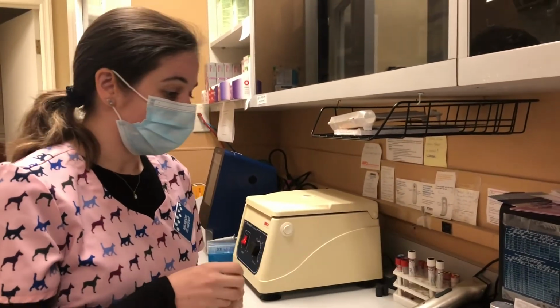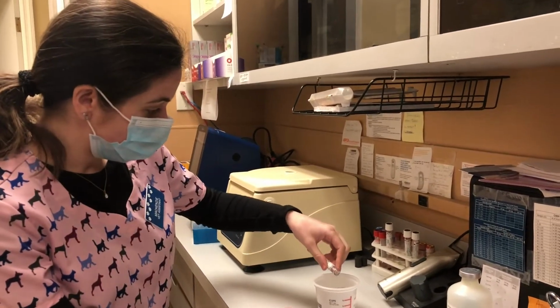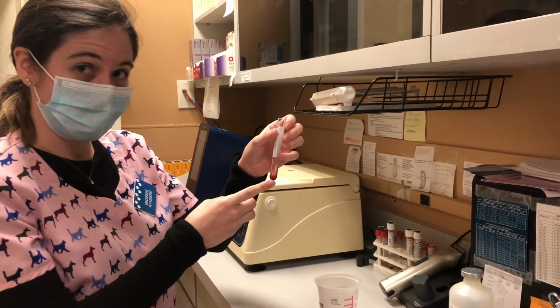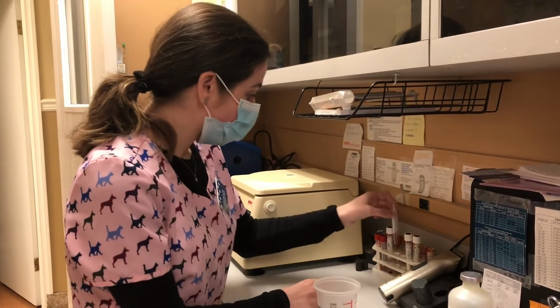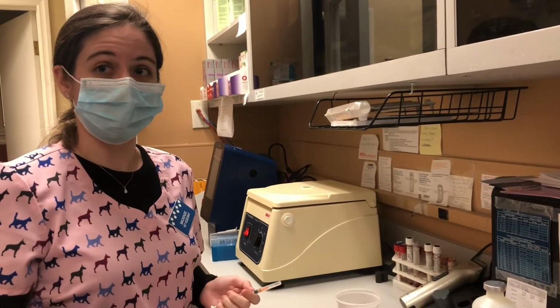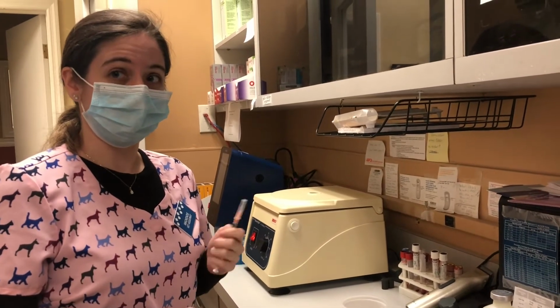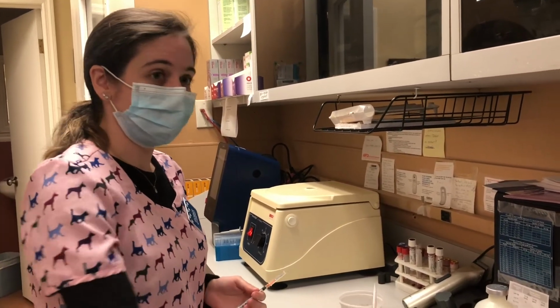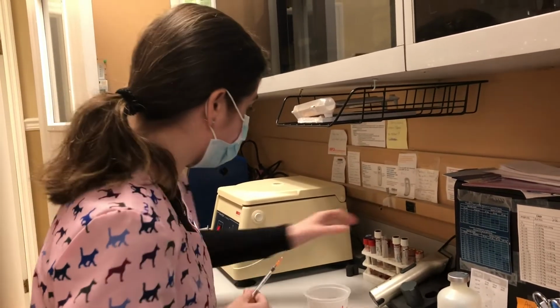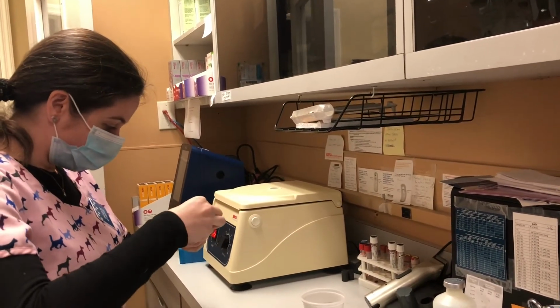What I'm going to do now is pour off my supernatant. All that I have left is my packed red cells. Now I'm going to make my erythrocyte suspension. It's going to be 2%, so what I need is 0.02 mLs of my erythrocytes, and then I'm going to fill the rest with 0.98 mLs of saline. This one happens to be for the recipient.